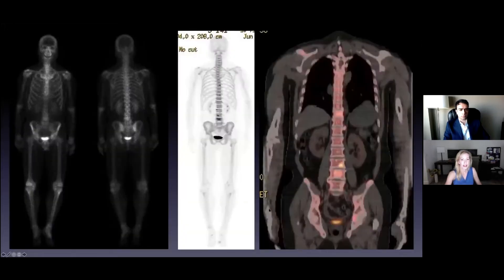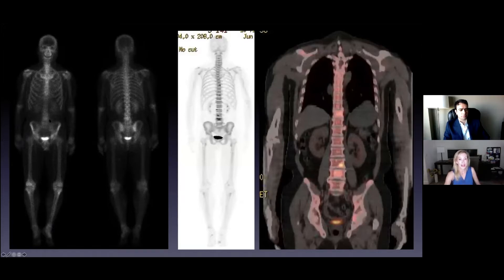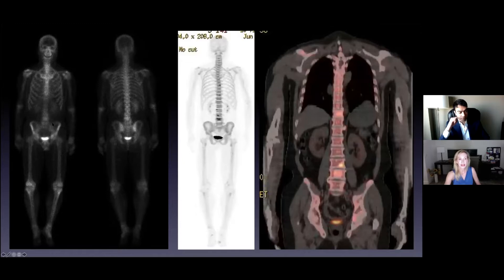These are the different modalities you're going to see and might order as medical students when evaluating patients with mets. The first thing is a bone scan — people still get bone scans. There's a little bit of uptake of radiotracer in the biggest met, which was here in L4. We do these front and back — an initial image and then a delayed image with more radiotracer uptake. This is a fast, cheap, easy way to see how widespread the metastatic disease is, because you can see the whole body. You can see if they have a met in their arm, in their skull, in their foot. Not the best anatomic imaging, but great for picking up certain kinds of mets across the whole body — very fast. And then you can get more advanced imaging later.